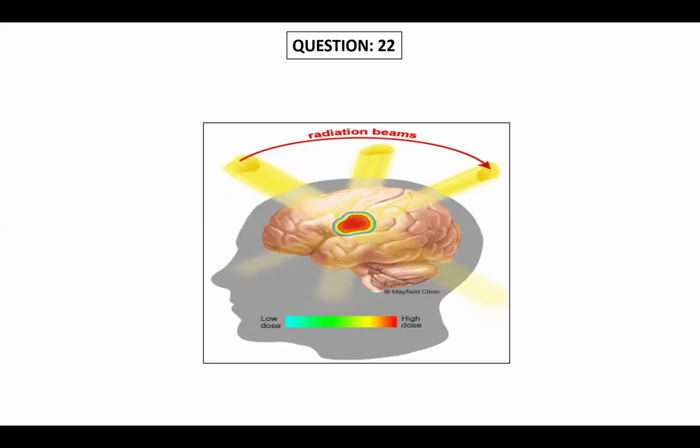Is there any specific difference in planning and evaluation for SRS plans? Sir, in the plan, mainly the beams are different. These are non-coplanar beams, not like other machines. Is there something different in your contouring or immobilization, or is it normal? Yes, sir. Immobilization and precision will be high. We have to treat under image guidance itself, and the margins given will be smaller compared to conventional planning, sir.